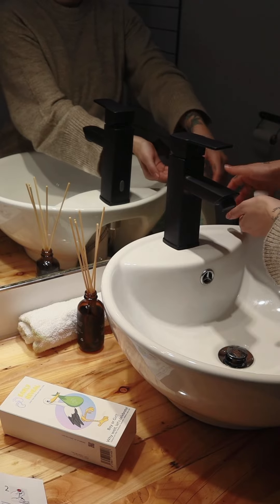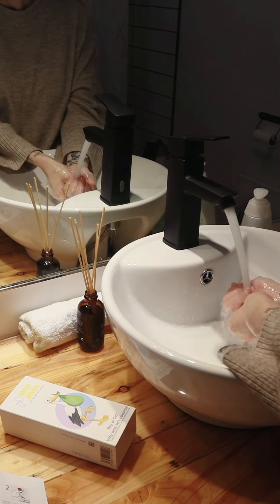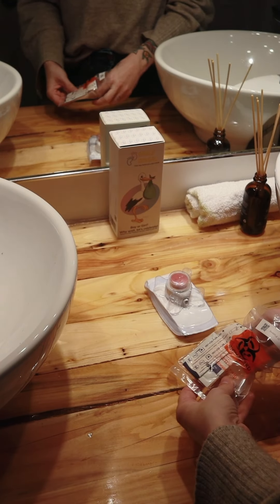Then, make sure to clean your hands and any surface that comes into contact with the test thoroughly. Next, gather all the necessary items to be able to perform the test.